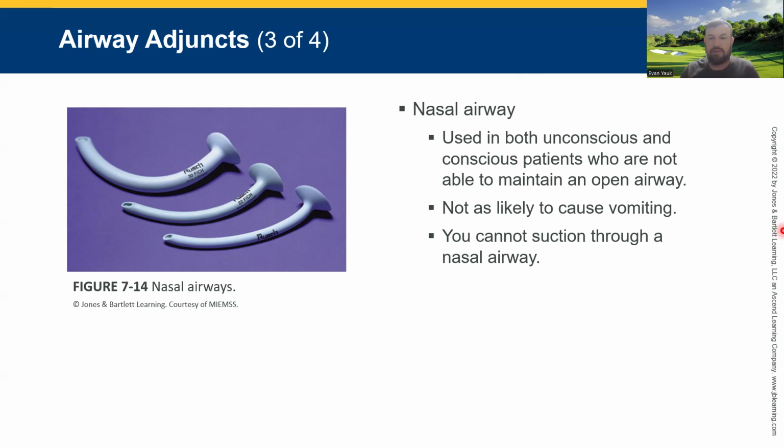You cannot suction through a nasal airway. If you remember that picture where the tongue was in the back of the throat that I showed you, this is going through your nasal passages, up, around, and right behind that tongue, giving us an airway, okay?